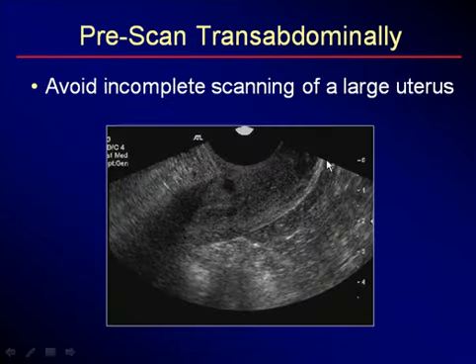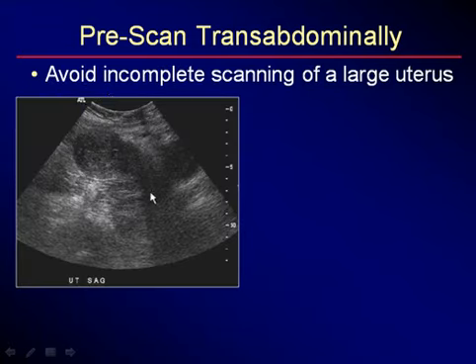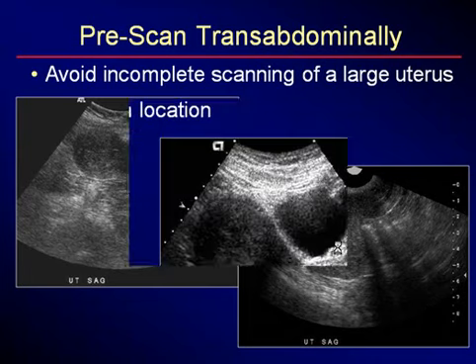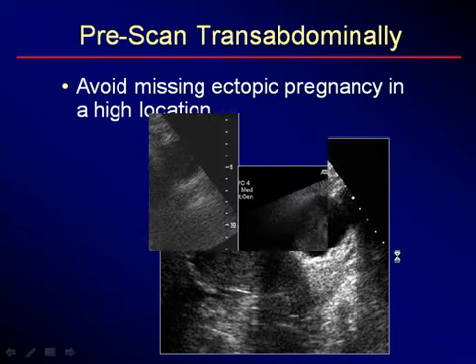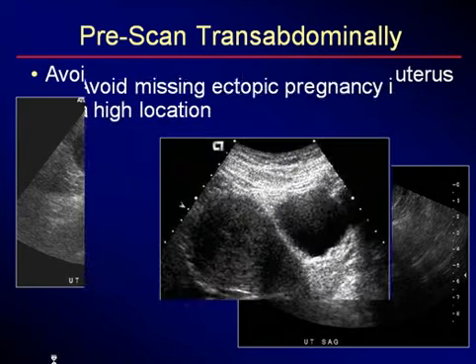Where is this only measured about 4 centimeters. Where's the rest of that uterus? So we knew that it was about 11 centimeters long. We searched more carefully, opened up the depth, found that it was really retroflexed, and found the entire uterus. What we were actually looking at was only the cervical part, and we were not imaging the corpus at all.